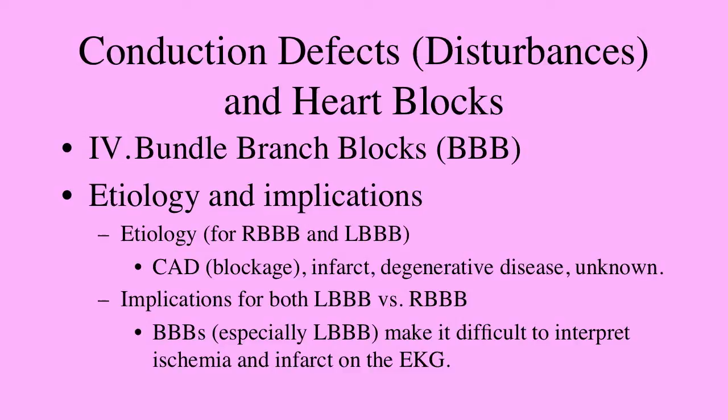Especially in the case of left bundle branch block, there's generally a standard that when you are reading the EKG, once you get to the point of making the diagnosis of left bundle branch block, you really cannot read the rest of the EKG. You just have to say, this is what I see so far.